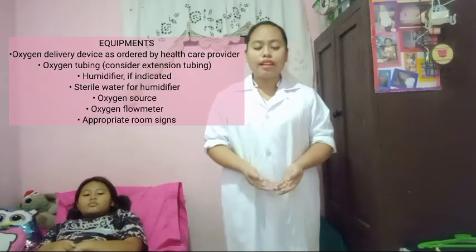For the implementation, bring necessary equipment to the bedside stand or over bed table. Perform hand hygiene and put on PPE if indicated.